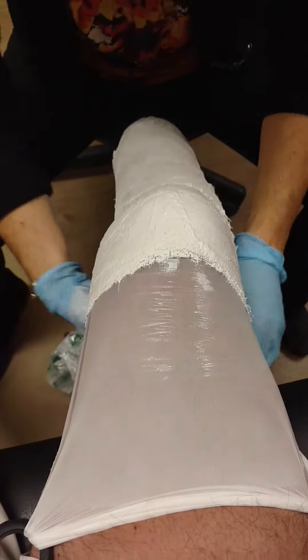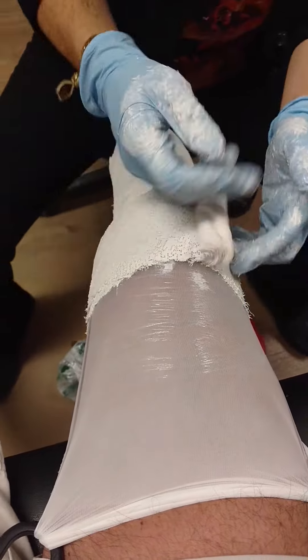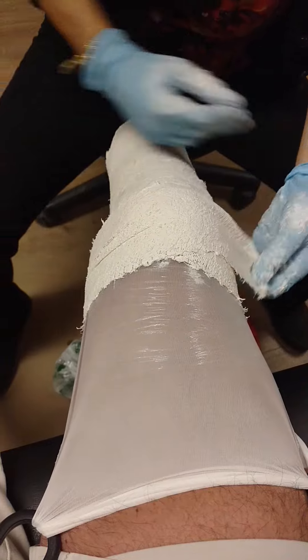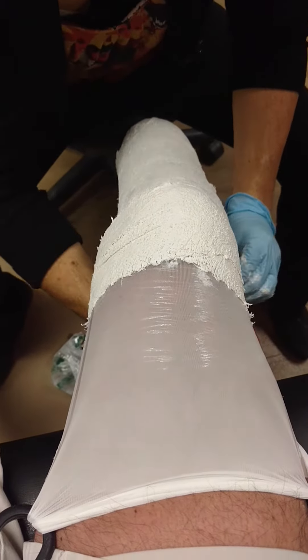So Amy, with the galls and the tape that's under there, is that going to affect the size of this thing? Well, it'll add a few millimeters at the bottom. But I hand modify these and I know that it's there, so I can just get a little tighter at the bottom.